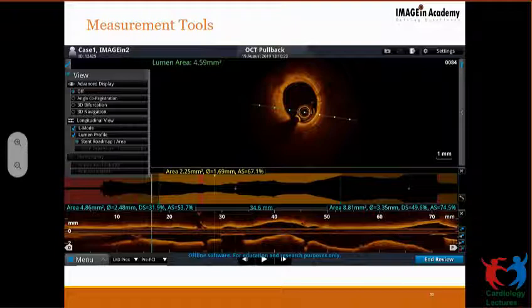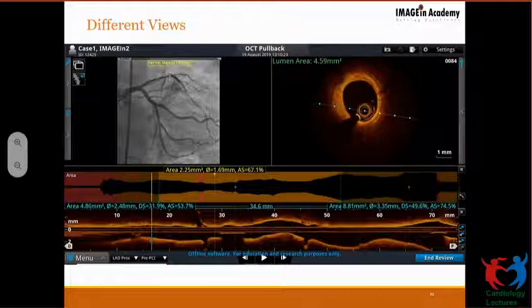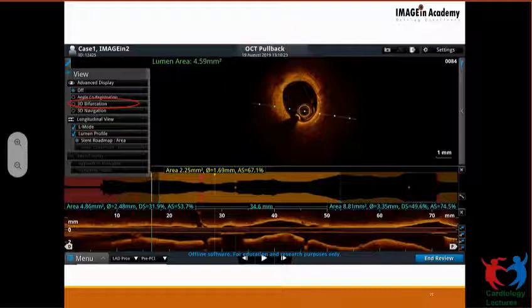And now this has multiple functions in it. As you can see, you have co-registration, 3D bifurcation, 3D navigation, L mode, lumen profile, everything. You click on any of these given buttons and they will come on the display. So if you press on angio co-registration, you get an angio co-registration image. So it's as easy as that.